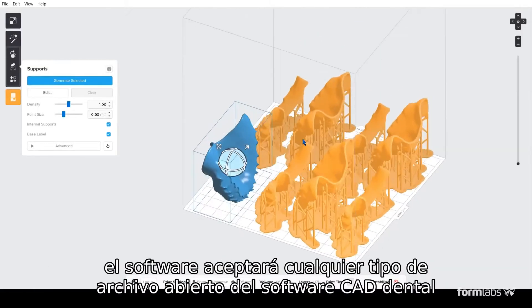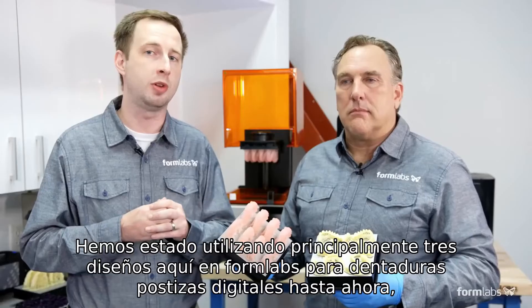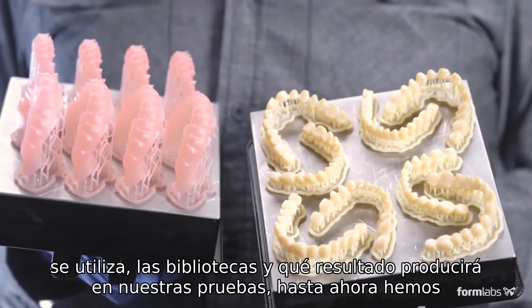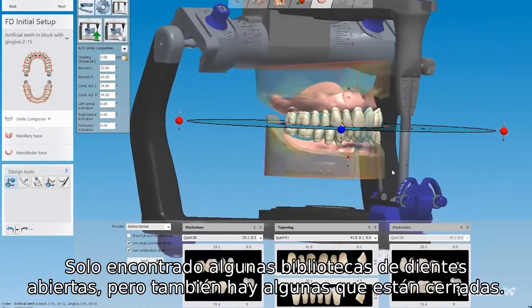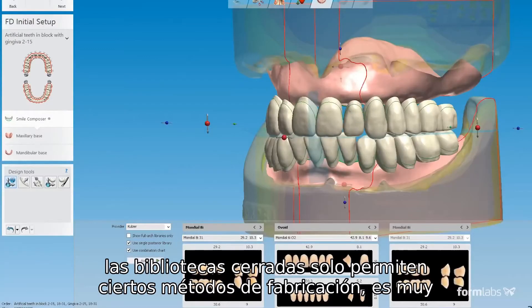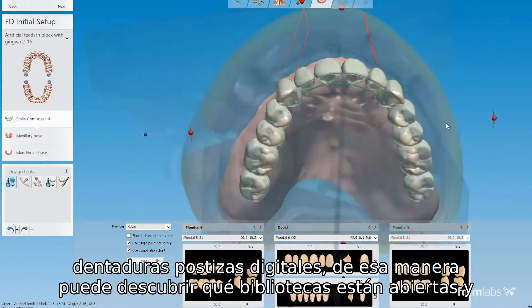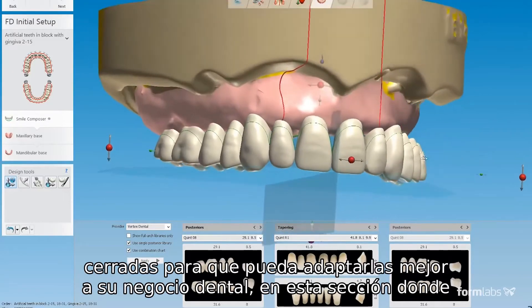Formlabs Preform software will accept any open file type from dental CAD software. We've been mainly using 3Shape here at Formlabs for digital dentures so far. But with any CAD software, it's really important to consider what tooth libraries are used and what output they will produce. In our testing so far, we've only found a few open teeth libraries, but there are also a few that are closed. The closed libraries only allow certain manufacturing methods. It's very important to test and try the dental CAD software that you will be using for digital dentures so you can discover which libraries are open and closed and fit it best to your dental business.